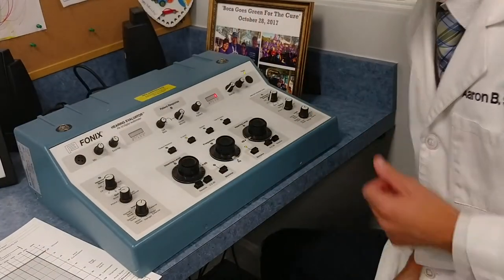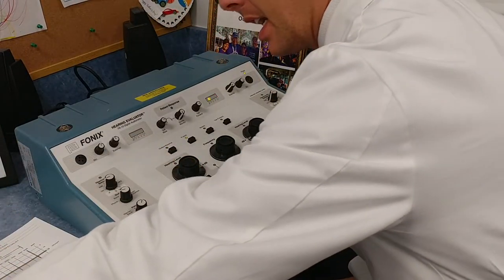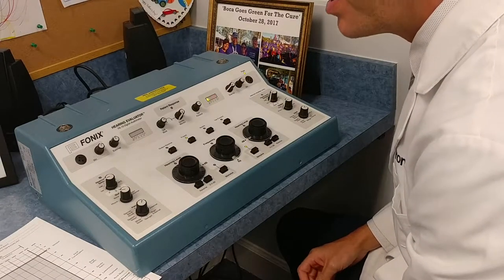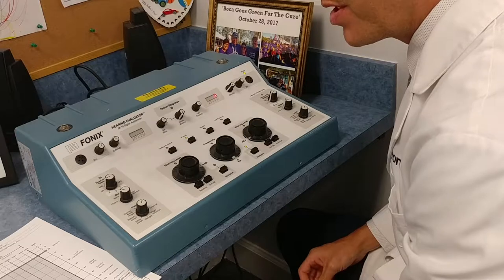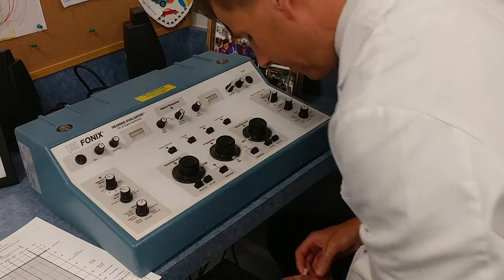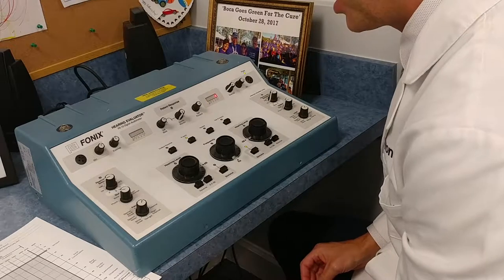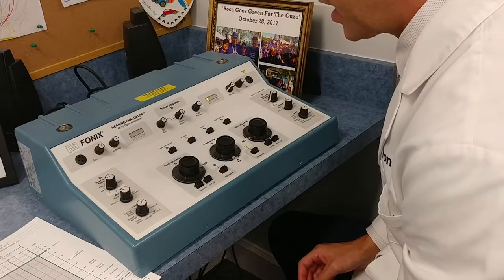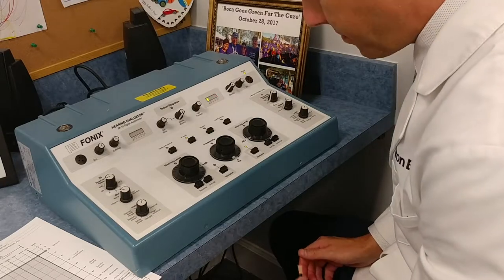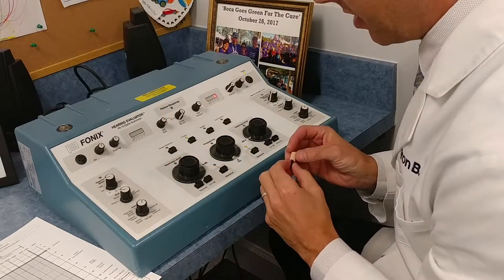Here at Auditory Precision, I'm going to go over an audiogram — how IHS likes to do it — and a bit about how to make the patient comfortable in the booth. The first thing is that if I have the patient in the booth, it's because I already got a thorough history on them. One of the things I need to know is if one ear is worse than the other, because I'm always going to start with the better ear. If the patient does not know which ear is better, I will start with the right one.